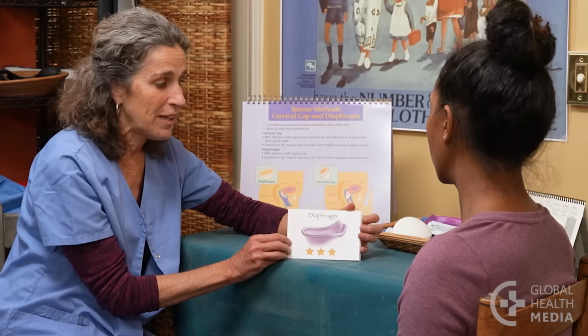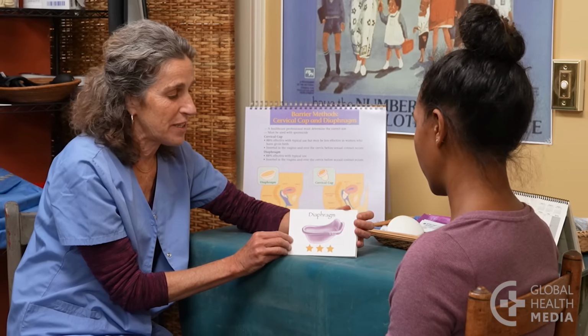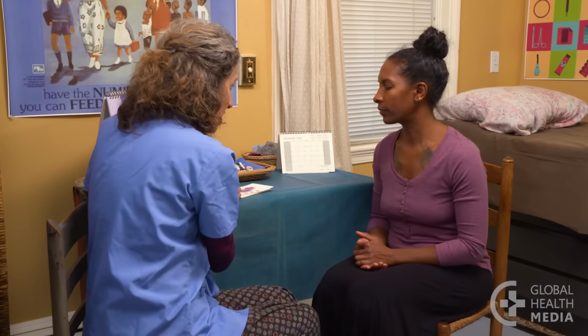Hello, welcome to our video series on contraceptive methods. In this video, I am going to show you the Caya Diaphragm and how to use it. A diaphragm is a flexible cup used with contraceptive gel that a woman puts up inside her vagina before sex to prevent pregnancy.